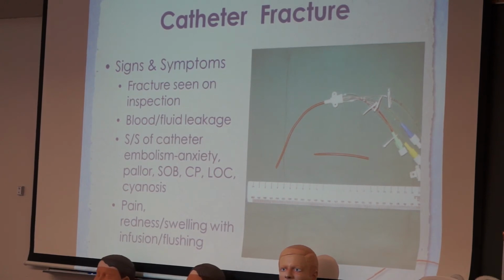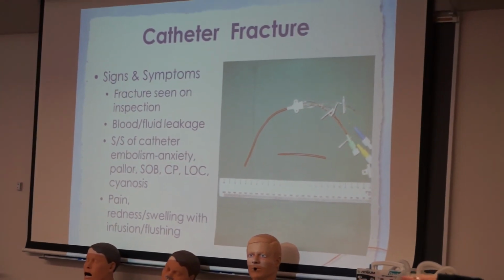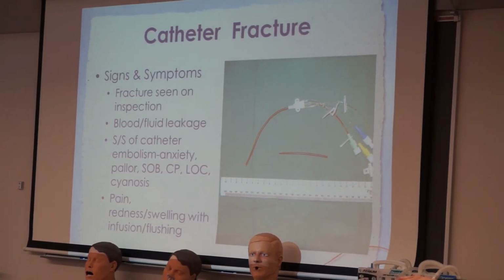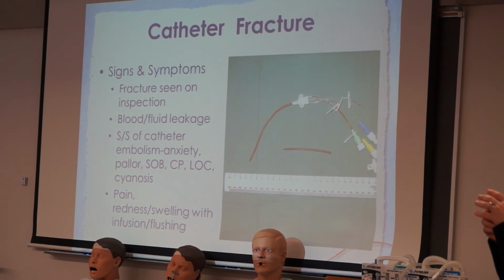Catheter fracture, not very common. I've never seen one of these. Have you ever seen one of these, Jana? No, I've never seen one, but the tip can fracture. It may not break completely. Have you seen one? Well, in interventional, we retrieve them. Oh, really? Yeah, I never saw one.